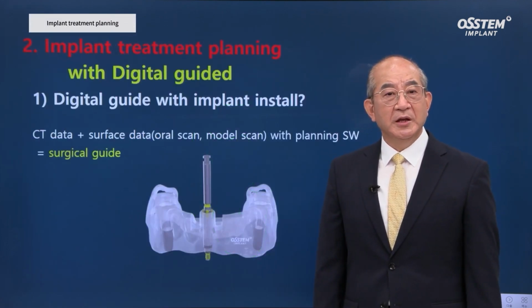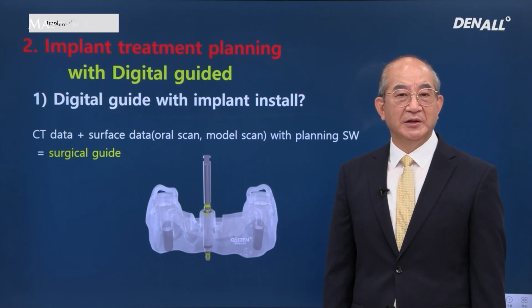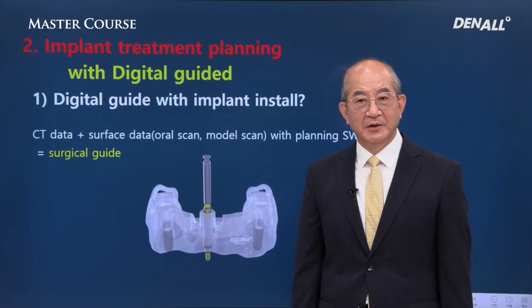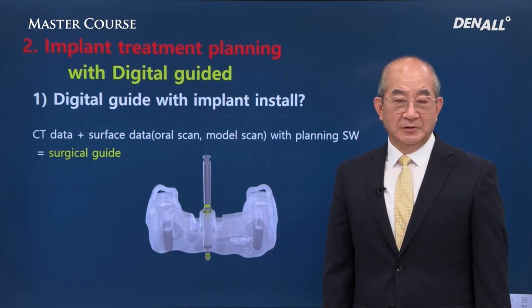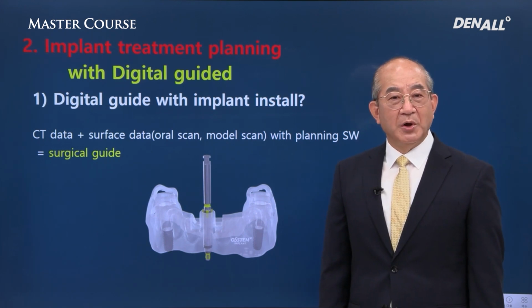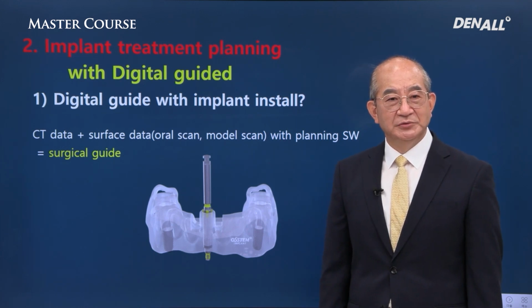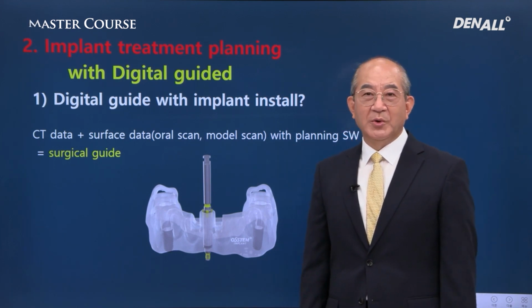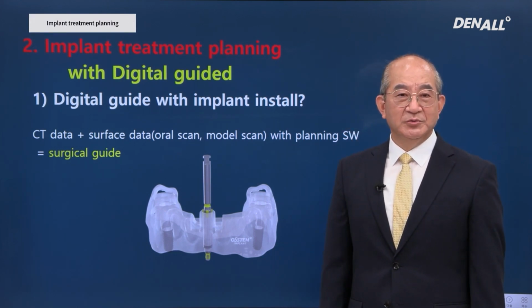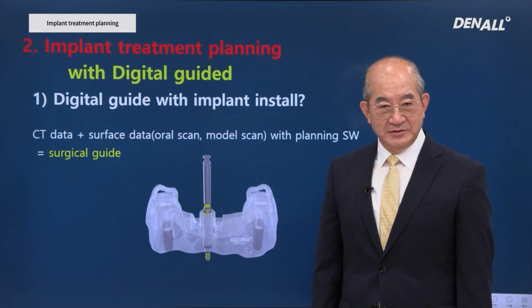Next, I'm going to talk about digital guided implant surgery, which has become more widespread these days. Those of you watching this program, how many of you know about X-ray film, which used to be used at dental clinics? What I'm trying to say is that in the past, X-ray standard and panoramic images were frequently used in the dental clinics in old days.